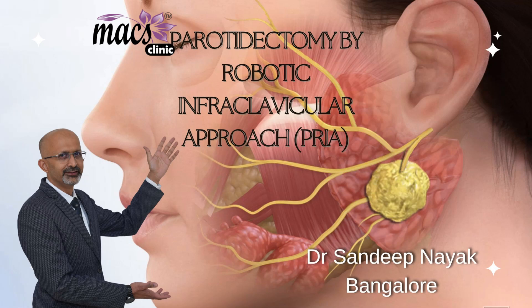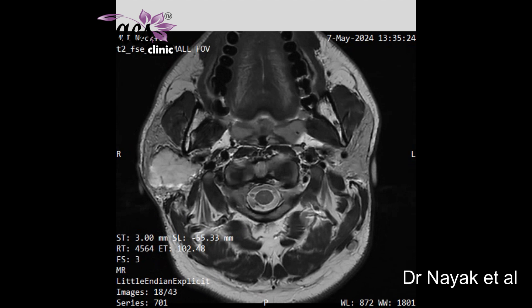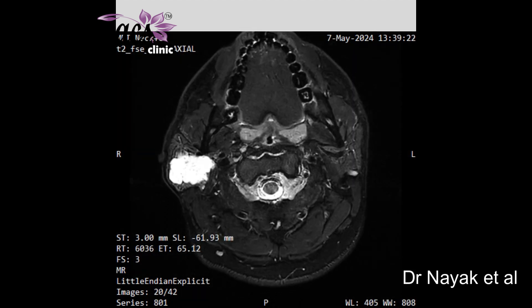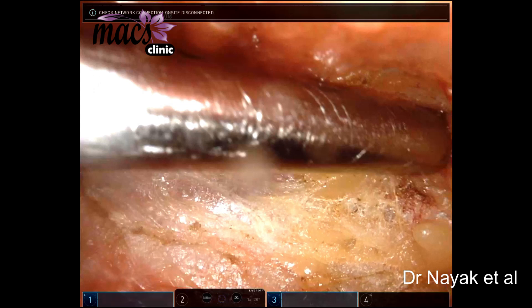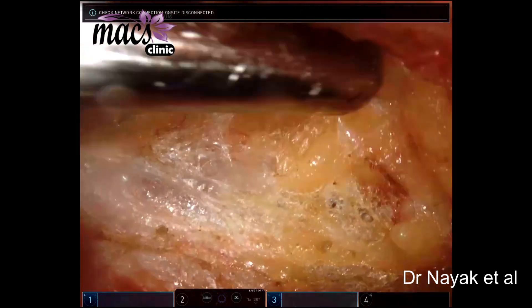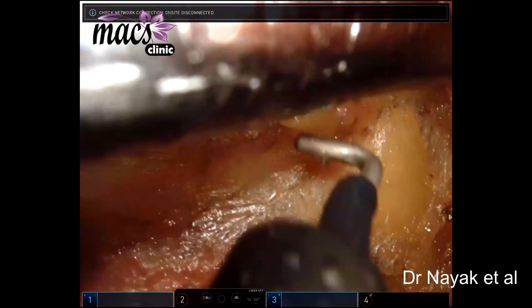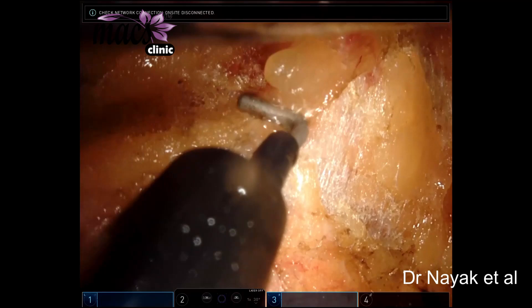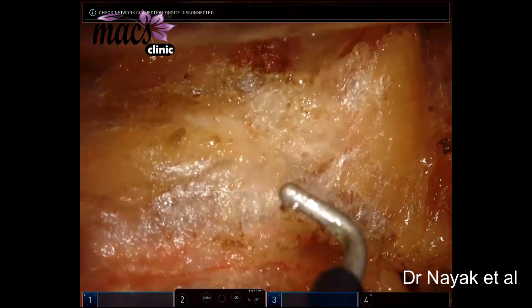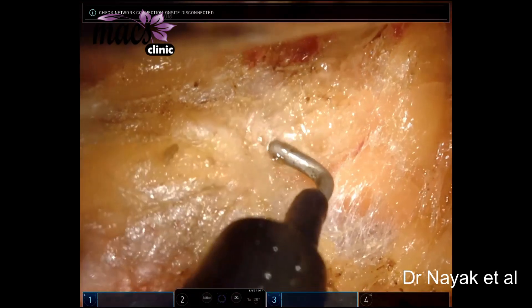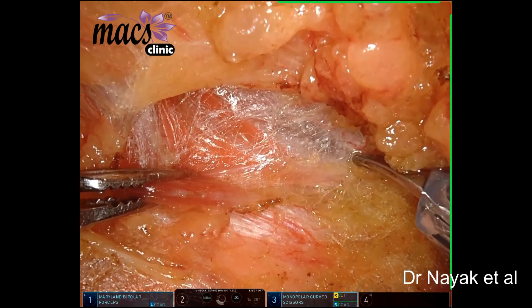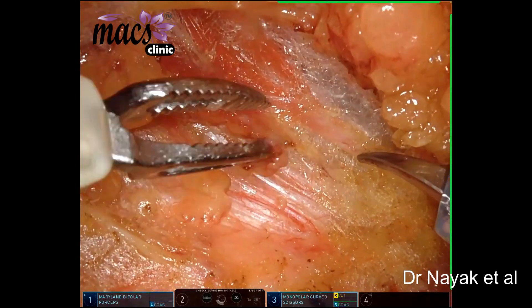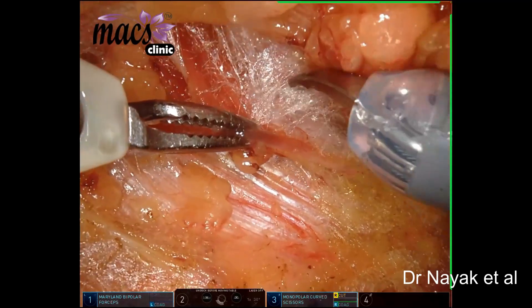This video demonstrates the technique of parotidectomy by robotic infraclavicular approach. As seen in this MRI, it is a deep lobe tumor. This is how we start the process of raising the flap. The flap is raised in the subplatysmal plane. This is the head of the right sternocleidomastoid.